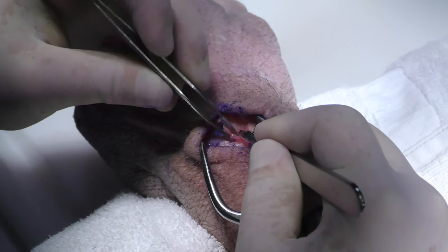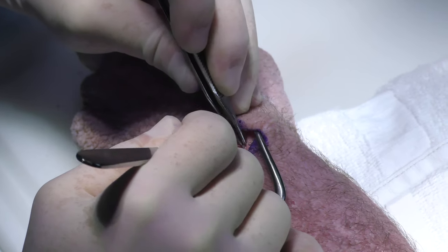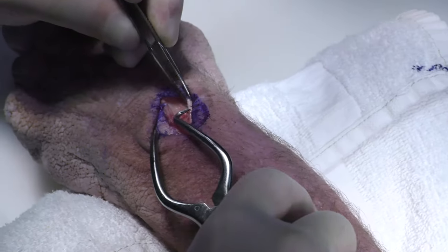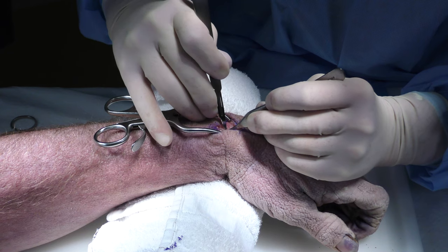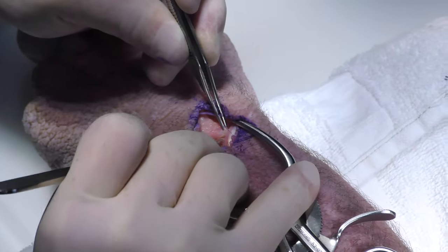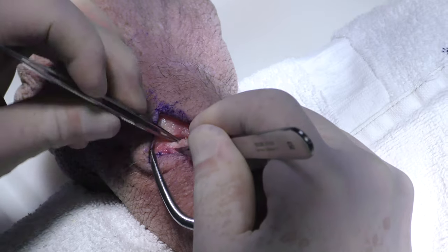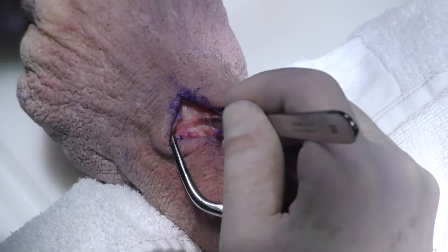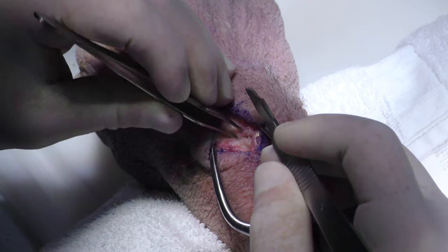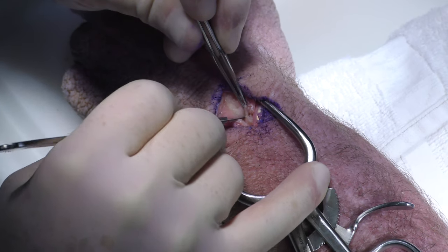So one of the ways that you can do that is, at the edge of your radius, which is right here, release some of that capsule. Let me get my EPL tendon out of the way now that we know that it's there. And you're going to elevate a little bit of the capsule up here, off the dorsal radius. And then come a little bit this way, and then we will make our capsulotomy. And there you're starting to see some cartilage.